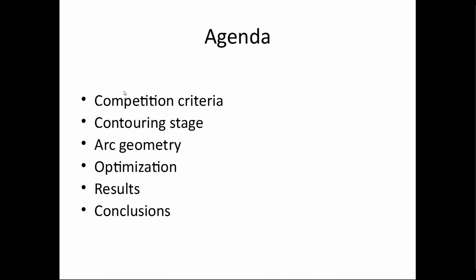So let's talk a little about the competition criteria, then the contouring stage, arc geometry, then optimization, to finish with the result and some conclusions.